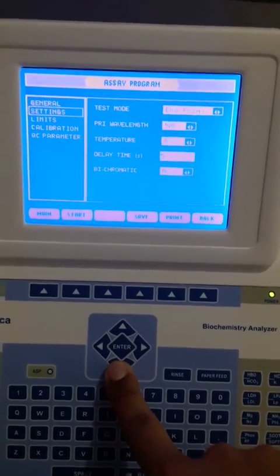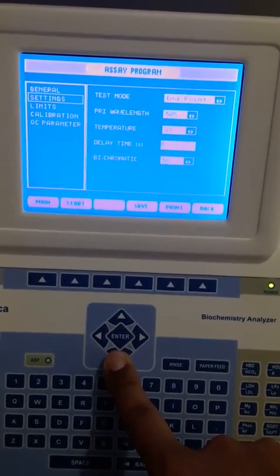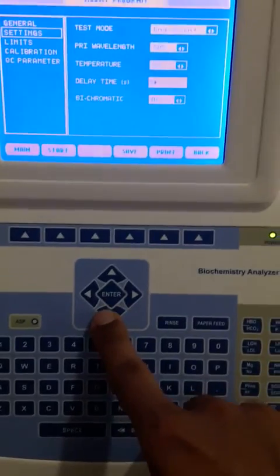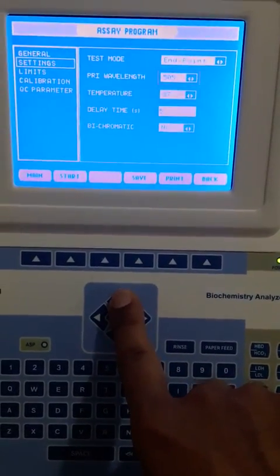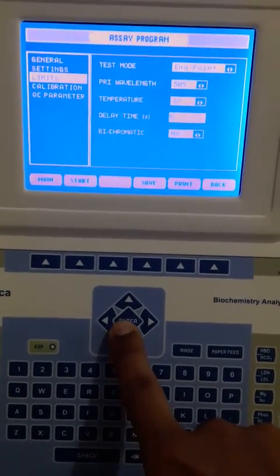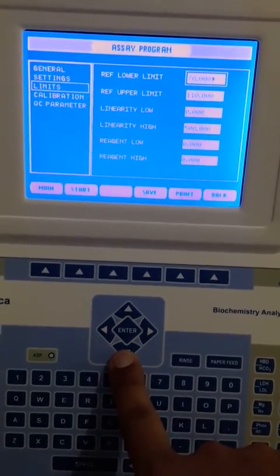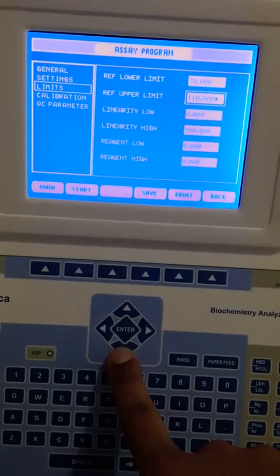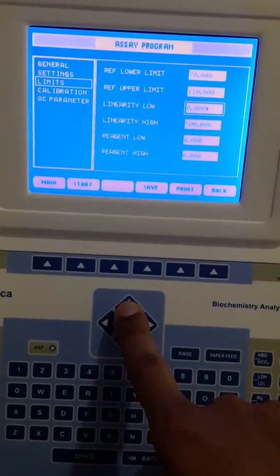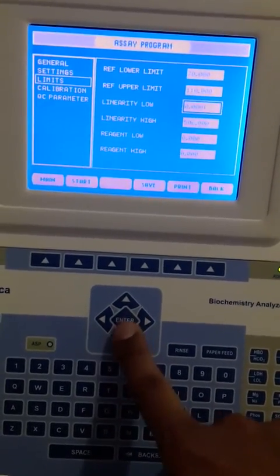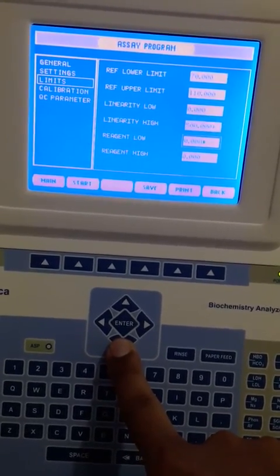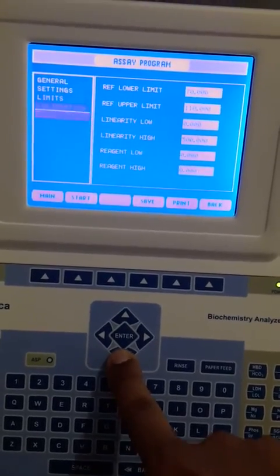In Settings, the endpoint wavelength is 505. The lag time has been entered, temperature is 37°C because we are going to perform this test at 37 degrees Celsius. The method is bichromatic. Limits are given: the lower limit is 70 and the higher limit is 110, meaning if the value comes between 70 and 110 it will show a normal result, otherwise it will indicate that the sugar level is low or high.